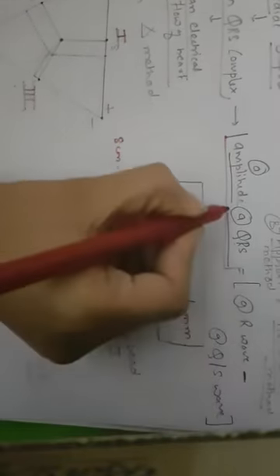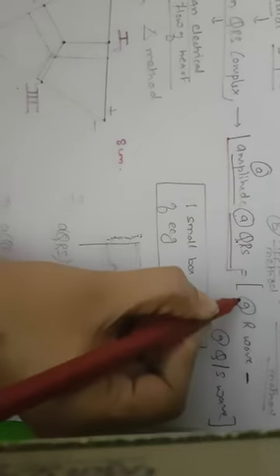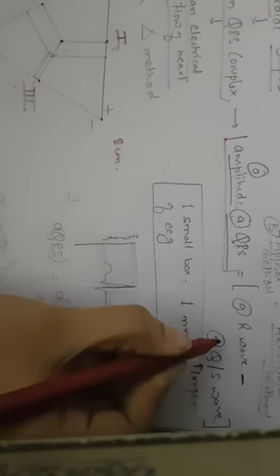Now how to plot the axis. First of all you know that on ECG, one small box is equal to 1 mm. So first of all you have to find out the amplitude of QRS complex. Now how to find out the amplitude of QRS complex? Amplitude of QRS complex is equal to amplitude of R wave minus amplitude of Q wave or S wave, whichever is larger. Okay, so whichever wave is larger you have to deduct it from the amplitude of R wave.